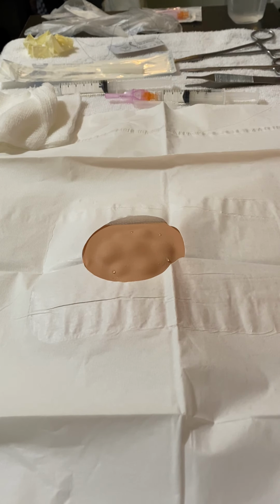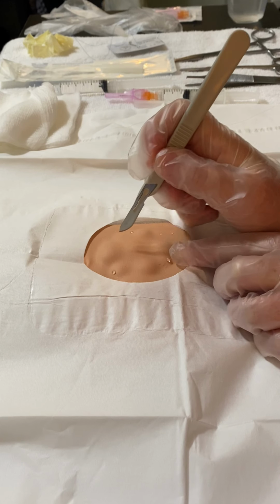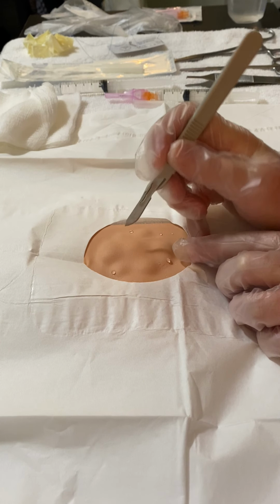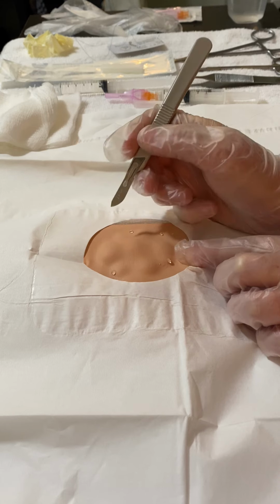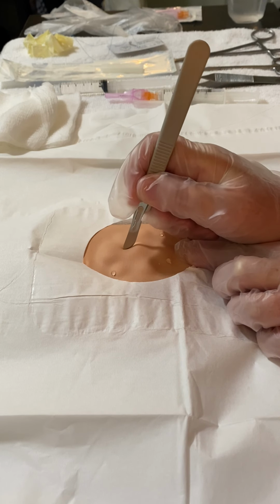And then for this portion, I'll take my scalpel and make a small incision in the top of the cyst area, being careful to attempt to not puncture through the sac of the cyst.